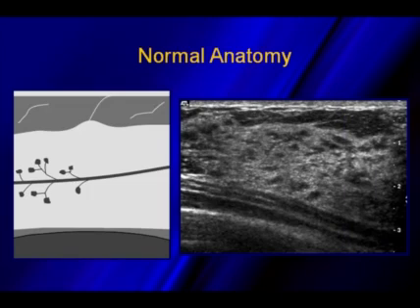So just showing you examples. Here we can see the skin that is echogenic. We have the pre-mammary fat. We can see a Cooper's ligament extending up. And here is our mammary zone down to the pectoralis and then actually down to the lung through here.